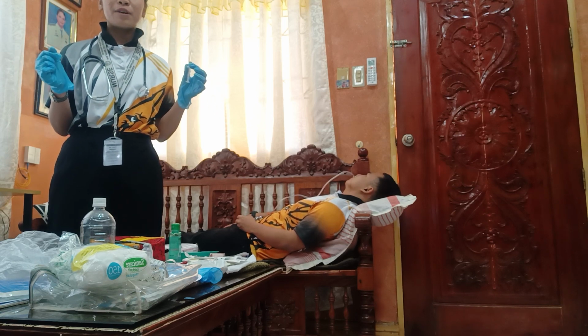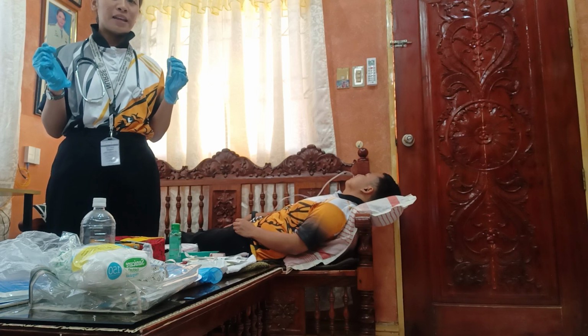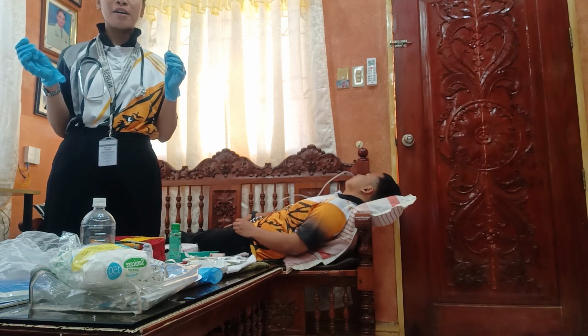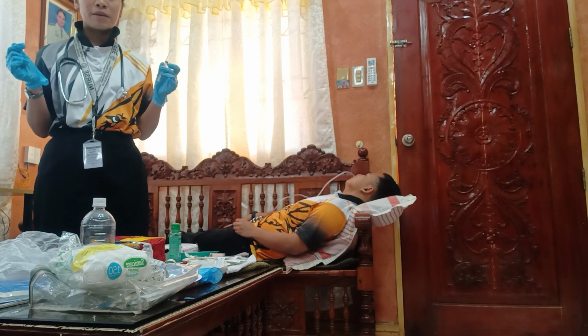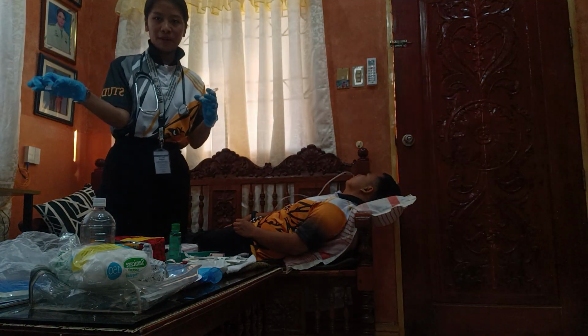And place a drop of the gastric secretion onto the pH paper or place the small amount in a plastic cup and dip the pH paper po. Ito po yung pH paper.